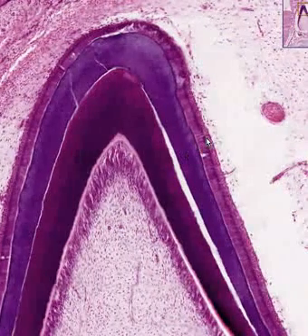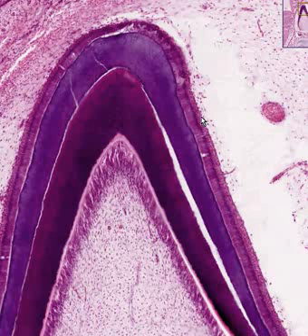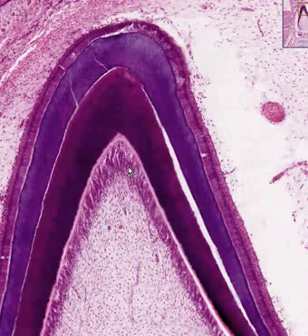The purple line is being produced by this beautiful array of ameloblasts just to the outside of it. This red line of dentin is being produced by this orderly array of odontoblasts just on the inside of it towards the pulp cavity. And I want to show you those two lines now, which we talked about before.